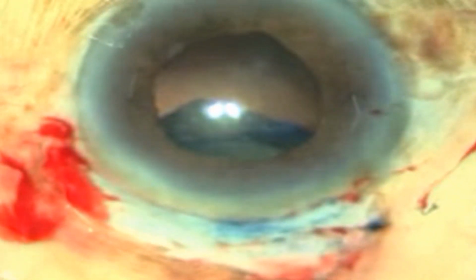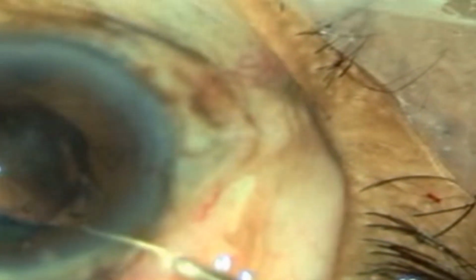In this case, a posterior assisted levitation method is used to lift the nucleus into the anterior chamber through the pars plana route using a nucleus rotation rod. The nucleus is then delivered by enlarging the limbal incision.